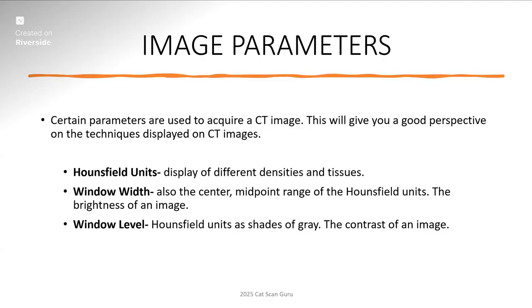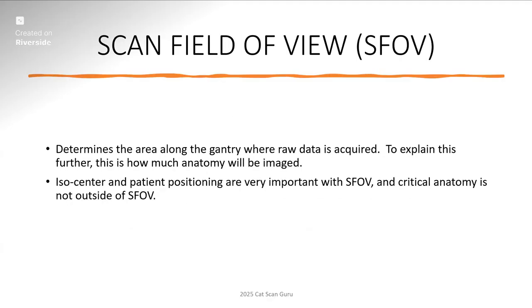So this is the contrast of your image, okay? If you look at a picture of an image, you'll see your window width and your window level, and you have different window widths and window levels for every type of exam, whether it's bone, lung, soft tissue, whatever the case is. Now, here are some very important principles that I'm going to go over, okay?